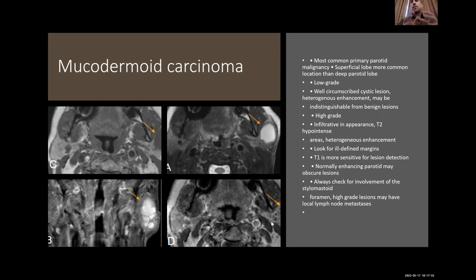one of the questions asking about the development of perineural spread. Both of them have a high incidence of perineural spread. Why is perineural spread important in the reports, and you have to give a comment on that? It is very highly upcoming in the NHS and in the FRCR exam, because perineural spread can change completely the management plan.